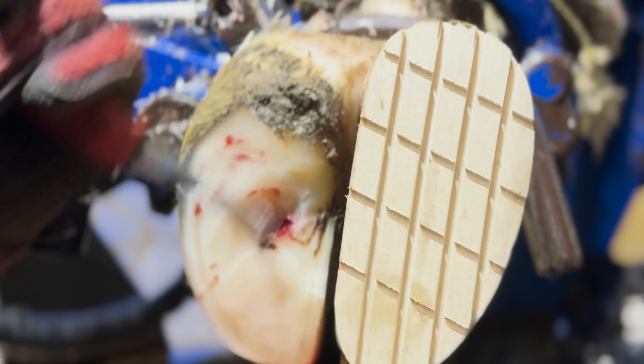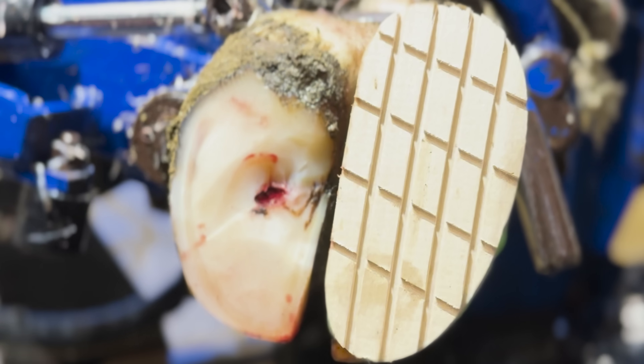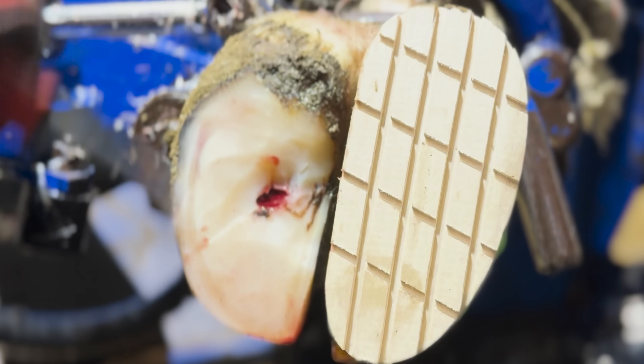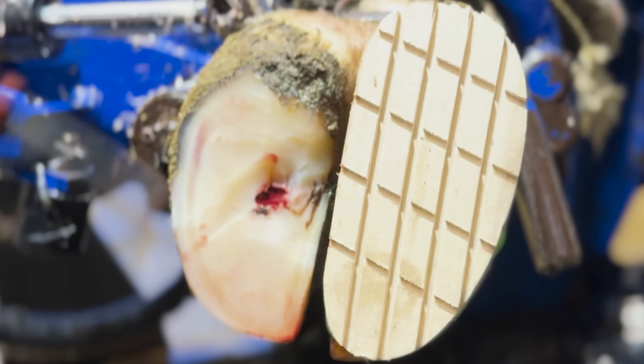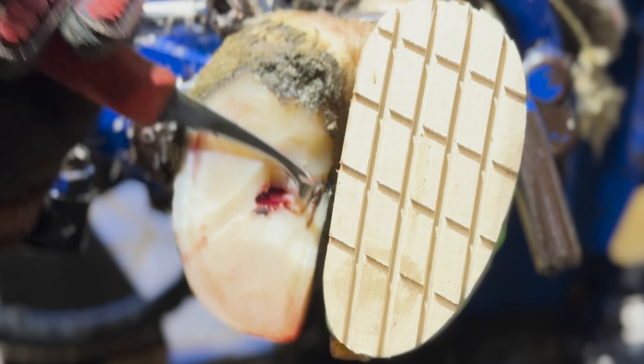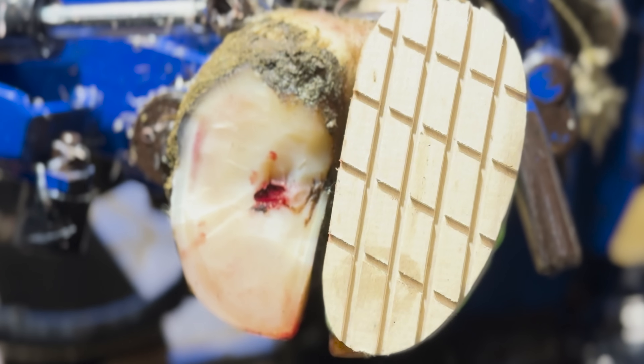As you'll sort of be able to work out now, there is nothing running out of this hoof, and it only starts running as I put pressure on and just remove more loose horn. This infection is still all built up in this hoof and we are just releasing all of that pressure.